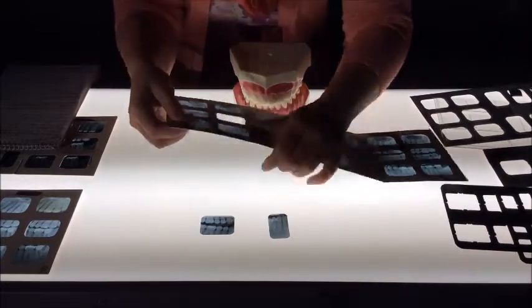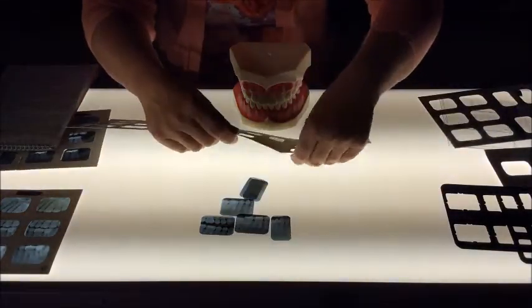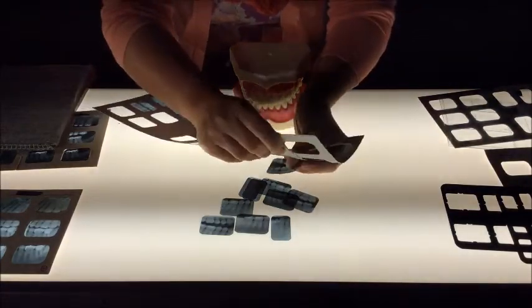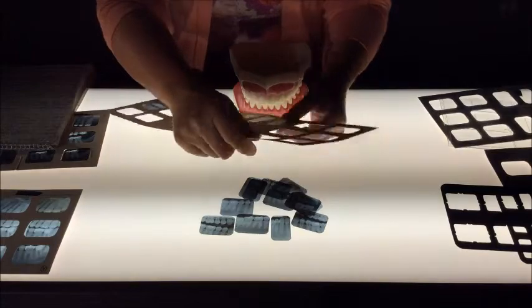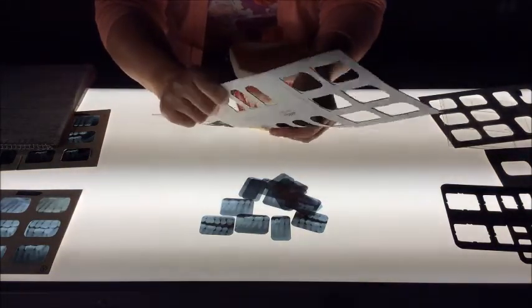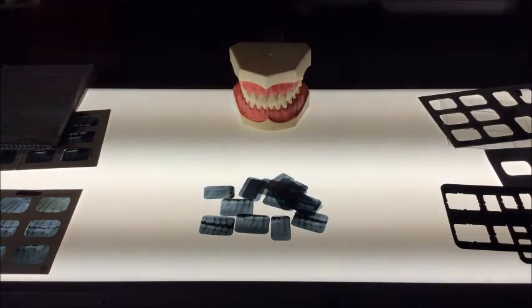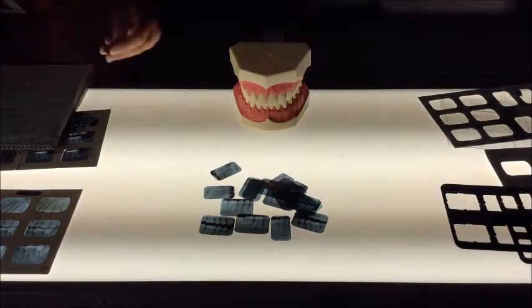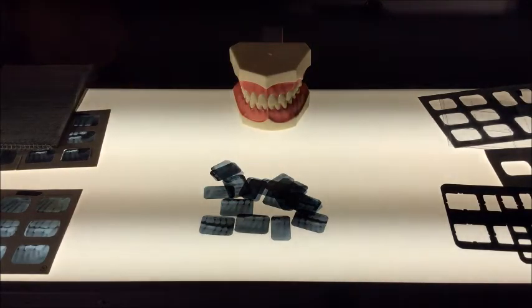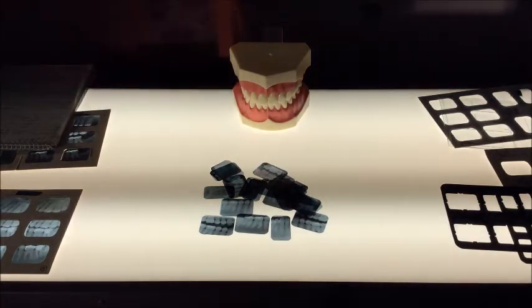So when we go to take our films, after we have processed our films and laid them out in a clear area on a light box, as you're seeing here, we want to orientate so that we can find on the films all of the identification dots, and they're usually in an upper or lower hand corner on the film. We want all of those dots to be convex for labial film mounting so that we can feel pimples.